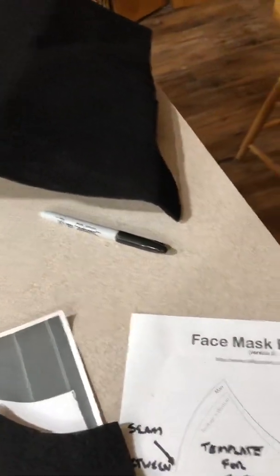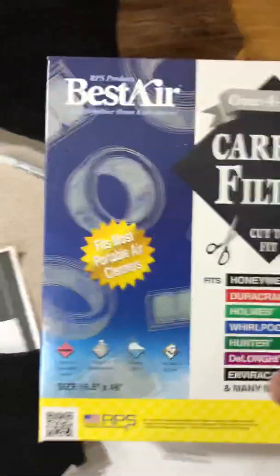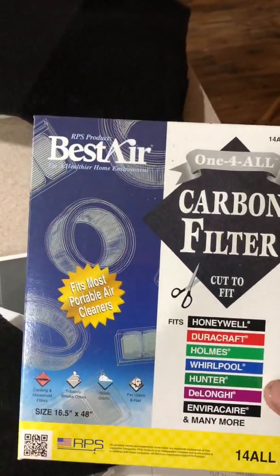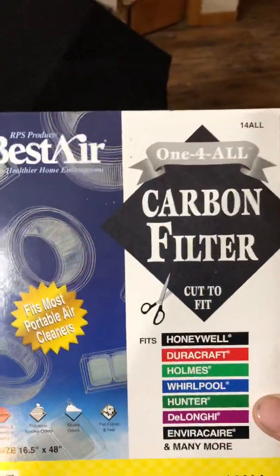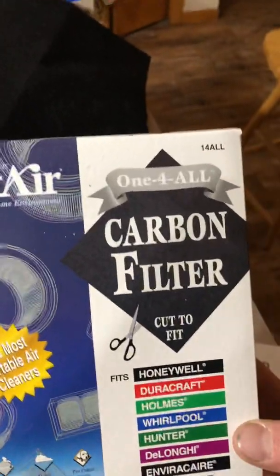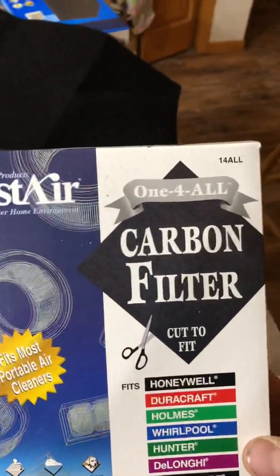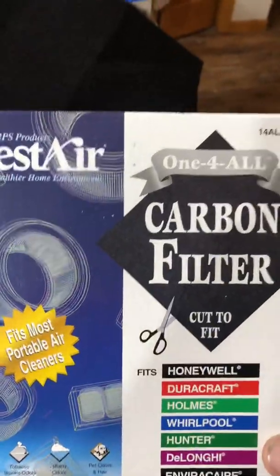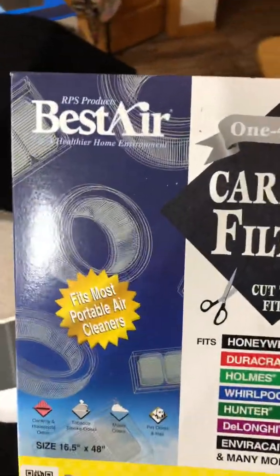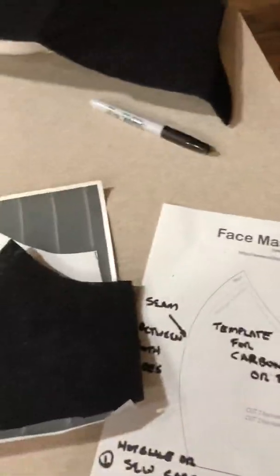Here is the carbon filter that I cut out that is going to get used. The carbon filter is good for a couple things: it'll give some rigidity to the mask, and carbon filters are used to keep odor out. So instead of healthcare workers or law enforcement smelling something and sneezing into the mask, the carbon filter should help with those things, and it gives the mask some rigidity.